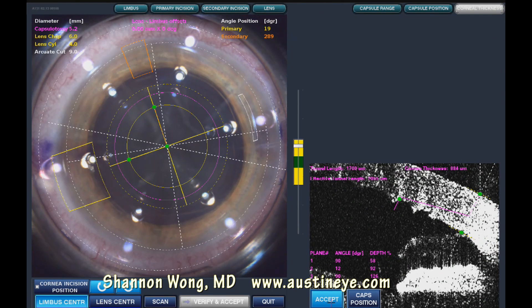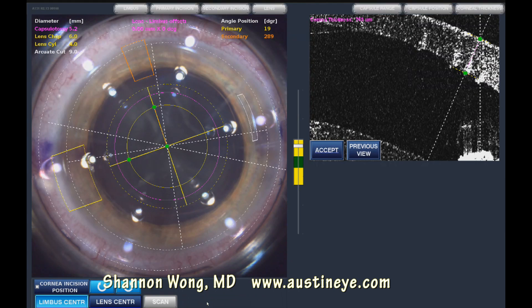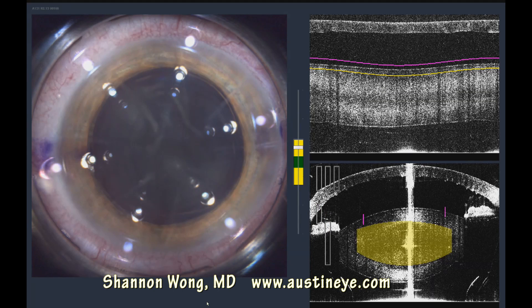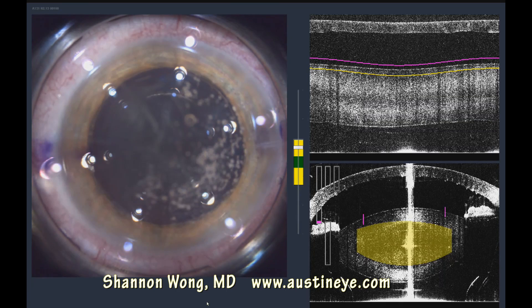My capsulotomy cut with the femto is about 300 microns above and below the capsular plane. Here we're confirming our lens chop, corneal, and arcuate incisions. Then we activate the laser, which starts with the capsulotomy first.